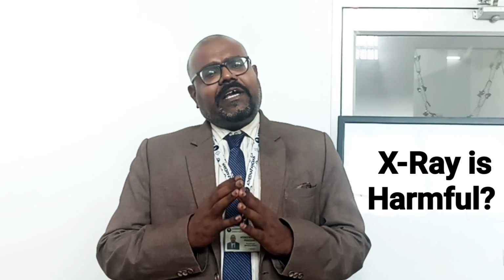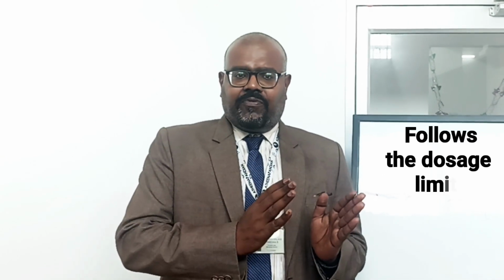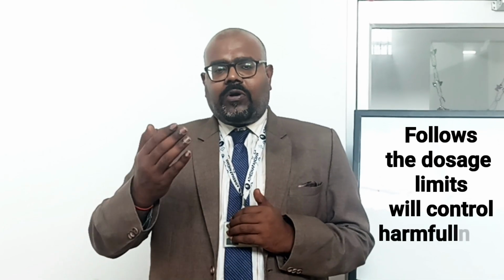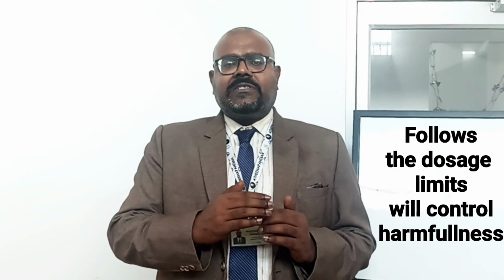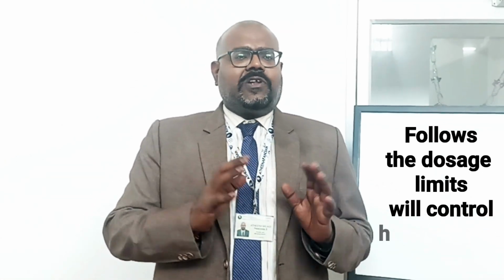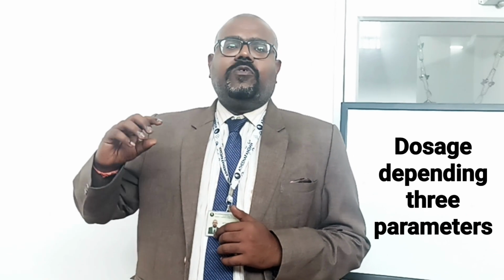X-ray comes under radiology. It is a radiation exposure. Whether it is harmful or not, yes, of course it is harmful, but if we follow the protocol and send only this amount of radiation to the patient, then it is not harmful. What is that range? That is called the dosage. How much dosage is given to this patient, and how much dosage is given to that patient?